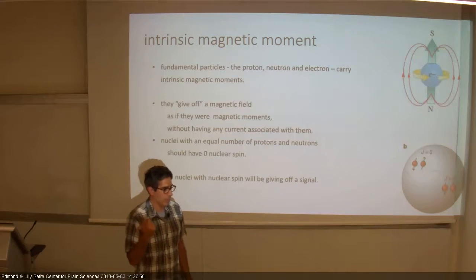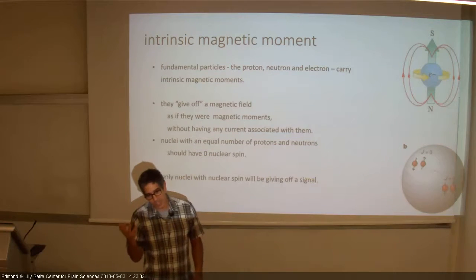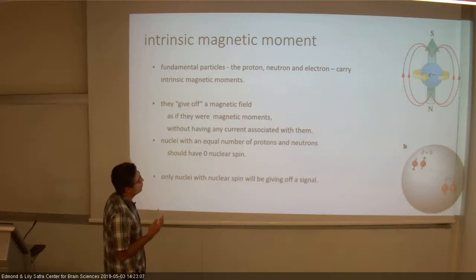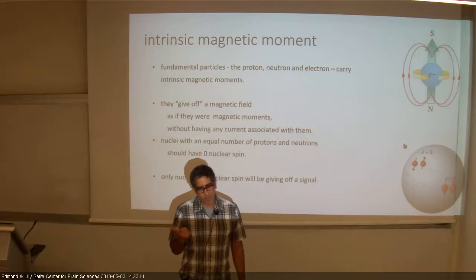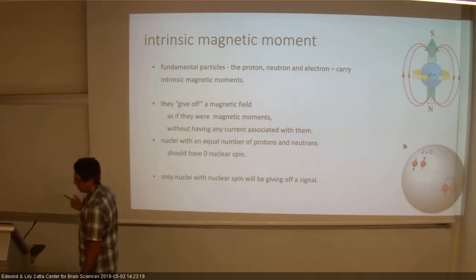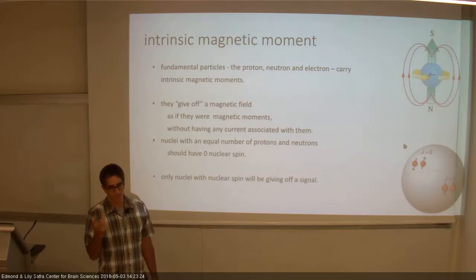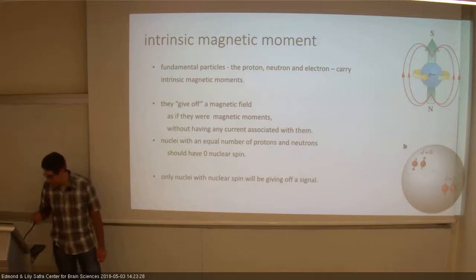There is no neutron in this. It's the simplest nucleus that exists in nature, and it also has a spin. It's simple. That's nice. It's very abundant. We're going to talk about it in a second, right? We are filled with water and we have hydrogen all over us, and it has a magnetic moment. All of that makes it the thing that we're going to use for our measurement.